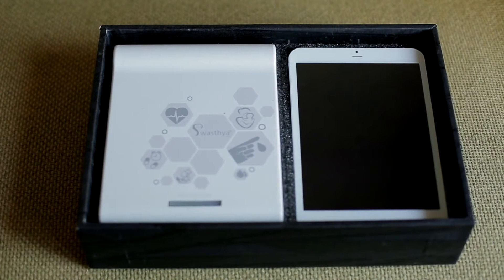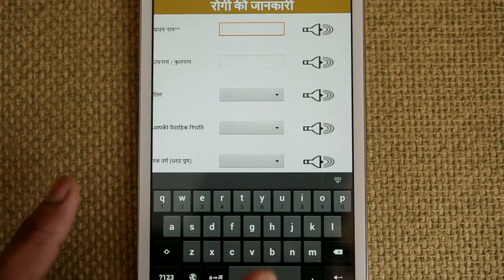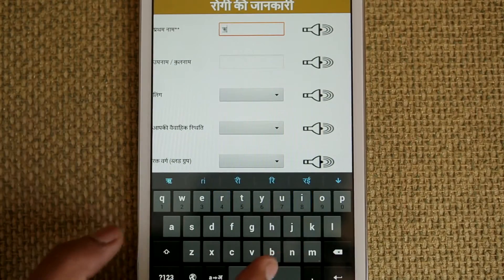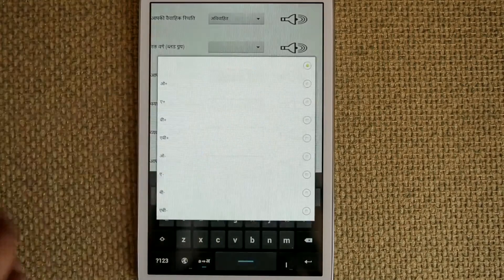The way Swasthya Slate works is very simple. You go ahead and turn the tablet on. You connect the peripherals to the interface unit. There's a Bluetooth connection between the tablet and the interface unit. Once that Bluetooth connection is established, you can actually go ahead and simply click buttons on the Android tablet, much like you would in any normal app. And that will actually go ahead and give you things like the ECG or the blood pressure, and it will show it for you in a live manner.